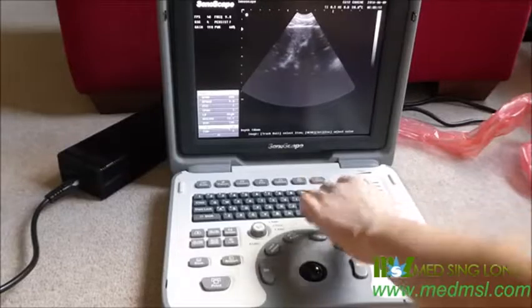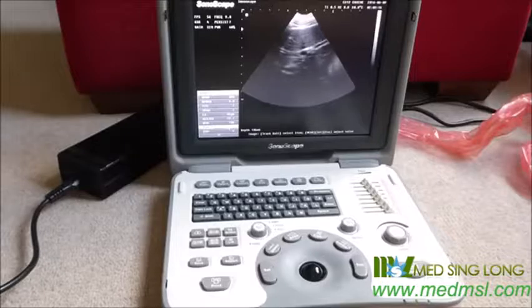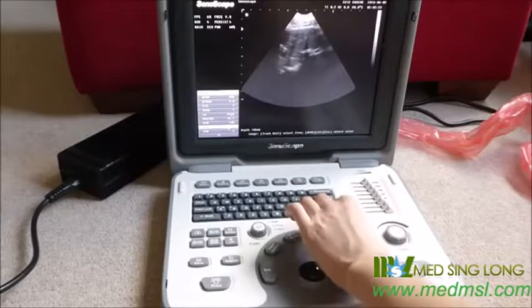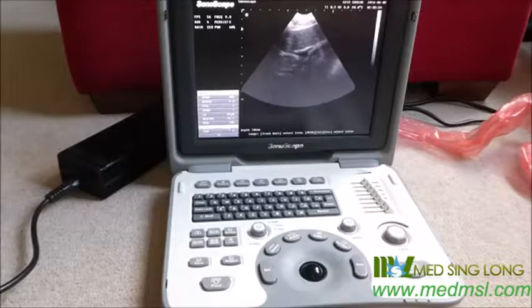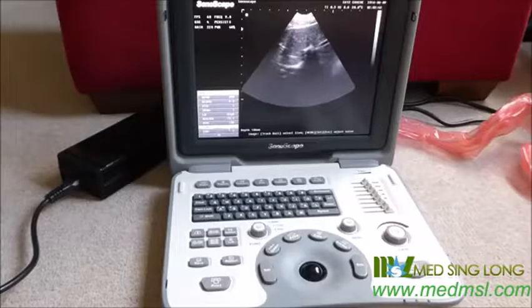If I turn it up high, the image is a lot smoother, and if I'm stationary, you can see it's actually quite a beautiful image. But if I move that fast again, you just see nothing. It's just a cloud. So again, I would just leave it how it is right now. But if you ever encountered that problem where you did have a dog that was sort of hyperventilating, which does happen sometimes, they do pant a lot, and your image was just too blurry and you couldn't get anything, then you might want to change that again.